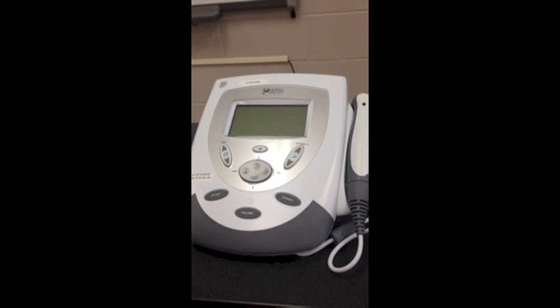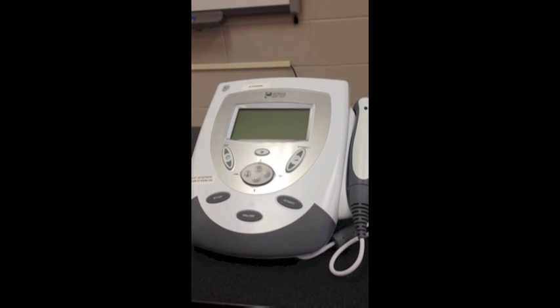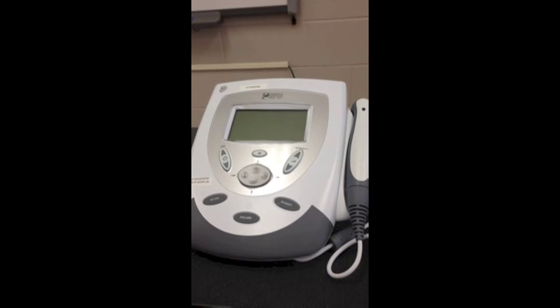How it works. Ultrasound uses acoustic or sound energy, which creates pressure waves that are transmitted into the underlying tissues and can be used through thermal and non-thermal effects.